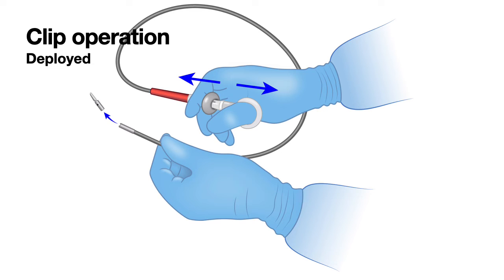It is important to make sure that the assistant deploys the clip when the endoscopist says to deploy the clip. Why is this important? If the endoscopist applies the clip and then says close, and he is not happy with that application and the bleeding is continuing, he would want the clip to be reopened, to reposition the clip and then close it to secure the blood vessel.